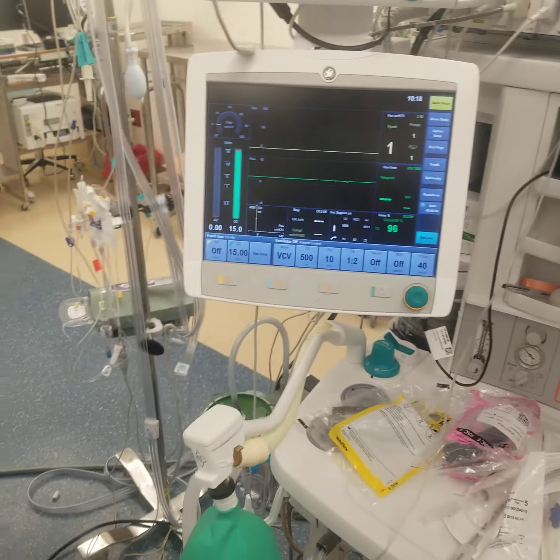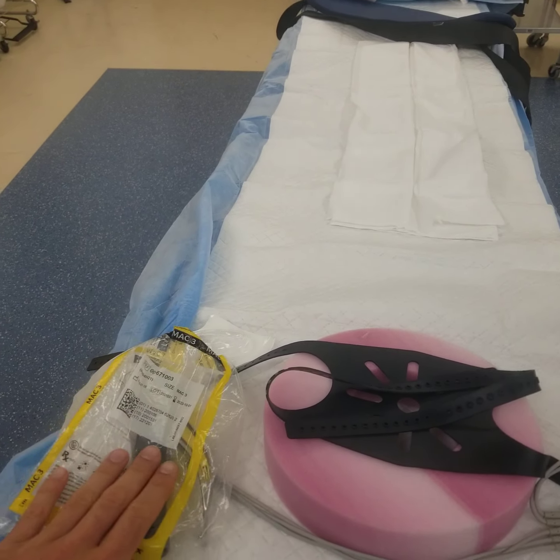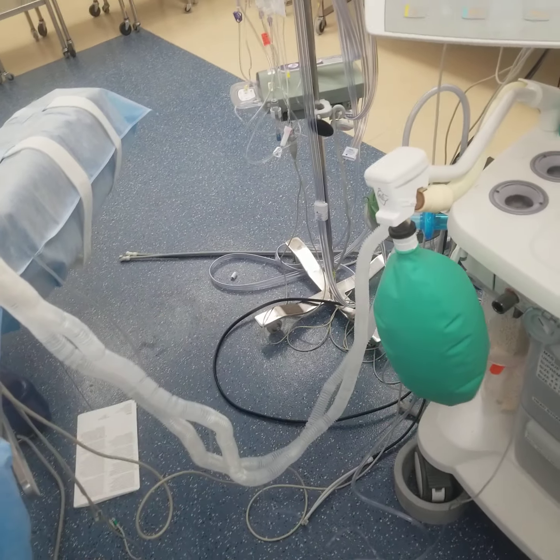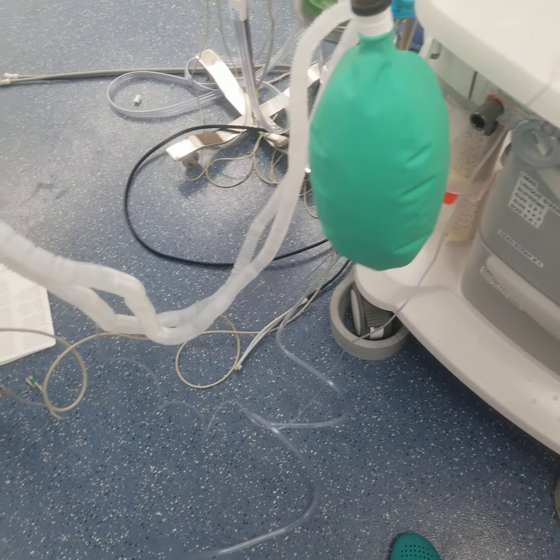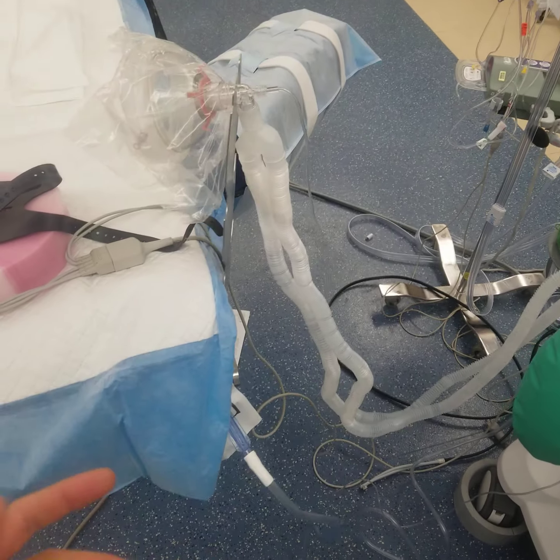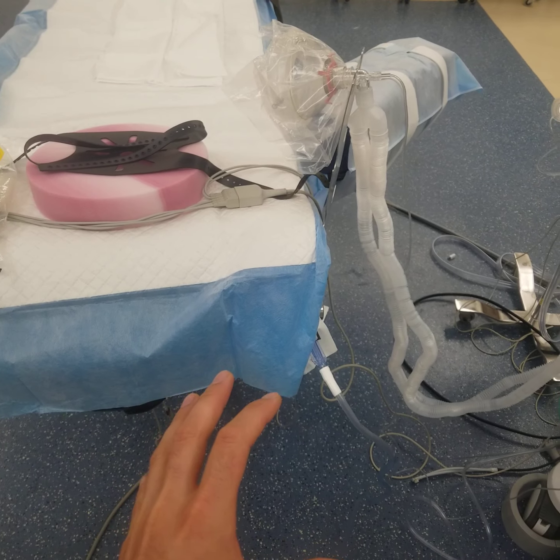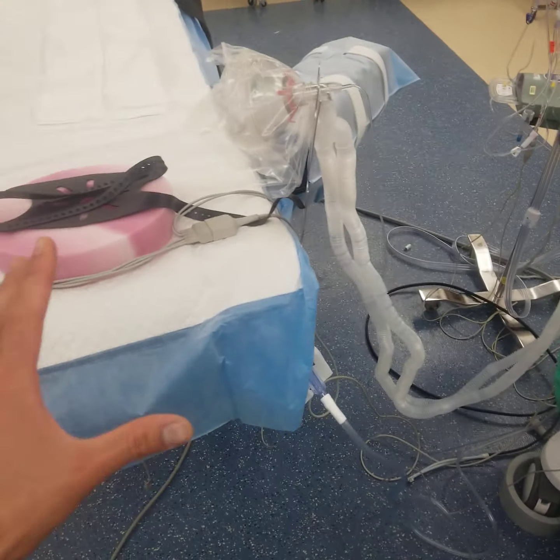My vitals are going. I have my airway ready. I might put my airway right here and then put my blade right here as well with the blade already out of the bag and ready to go. And then to look really good too, have your suction right under the bed here. And it honestly serves no more purpose having it, let me just use my other hand here, with it being here or there. But for some people that you're working with, seeing it right at the head of the bed makes them feel more comfortable and lets them know that it's working. Versus when it's over there, they don't know if it's working. But now they can hear it, and you just look really prepared.